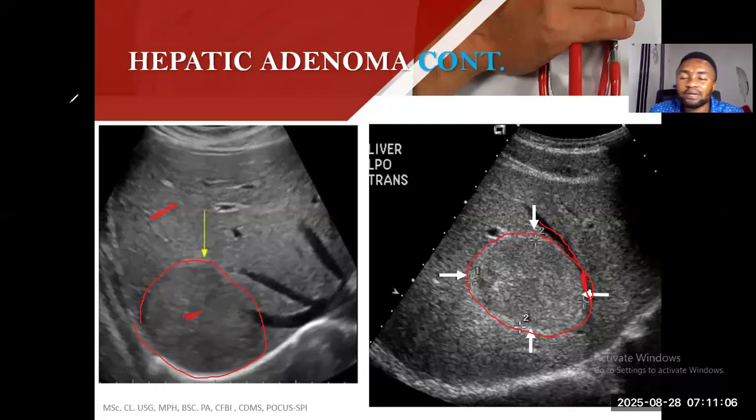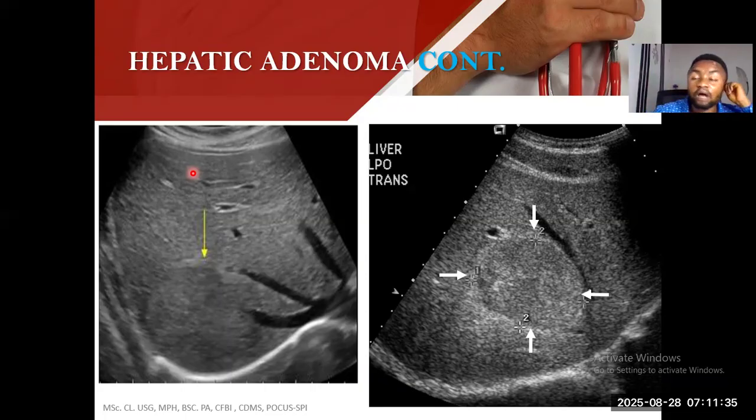So you have to be careful as a sonographer. When someone is scanning and making a call at the same time, it doesn't make sense. You are scanning someone and you are making a call. Please, these things, you miss them, you won't see them when you are making a call. You are double concentrated. How can you see this? Do you understand? Put your phone somewhere whilst you are scanning. If you are making a call, just take permission from the patient and make your call. Afterwards, start again. That's all. All right.